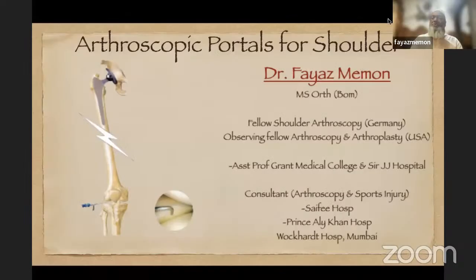So today I've been interested with this topic, arthroscopic portals for shoulder. And as we all know, shoulder arthroscopy is all about doing larger stuff through smaller portals. So your portals need to be in perfect place depending upon where and what you're operating.